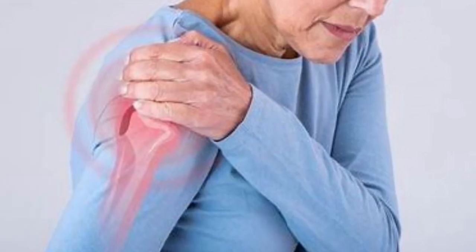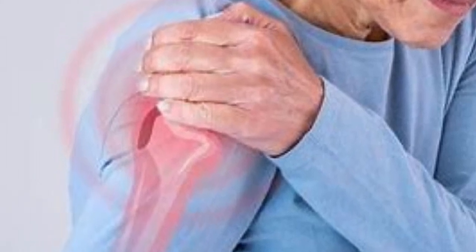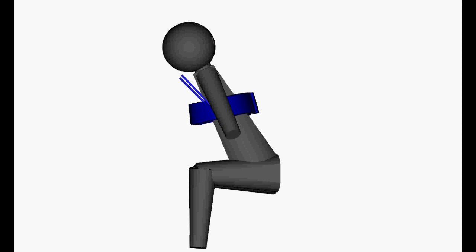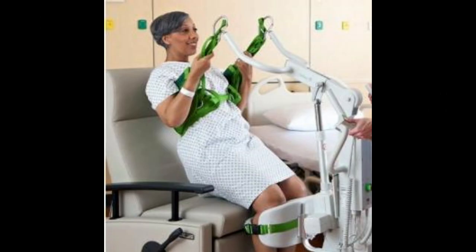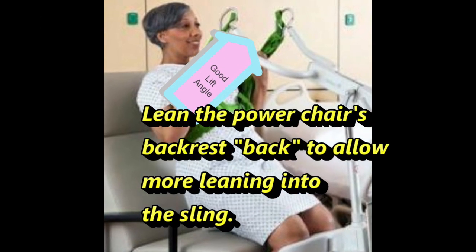So, where does the fear in some people come from that using a sit-to-stand lift will hurt or cause pain in the shoulder area? In my humble opinion, the only way a lift can be painful to the shoulder area is if the patient allows his upper body to lean forward where the sling might be pulled directly up and into the shoulder area. As I explained, a simple leaning back with your head and upper torso allows a gentler lift arc of the body from the seated position.